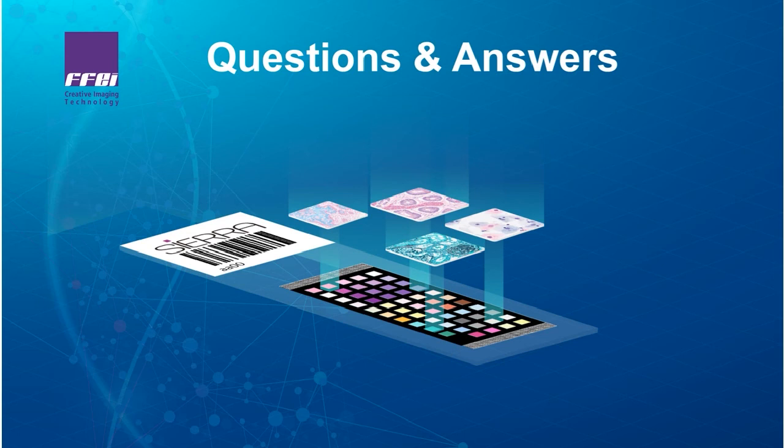Thanks. Okay, and then the next question that the same audience member has asked is, if I have an AI project with 500 digitized slides, do I have to correct colour for all the 500 slides? I'll jump in and take that one as well. No is the answer. So if you've got 500 digitized slides from the same scanner, depending on an established, say, color drift of that scanner, it should be entirely feasible to use the one correction for all of the slides.